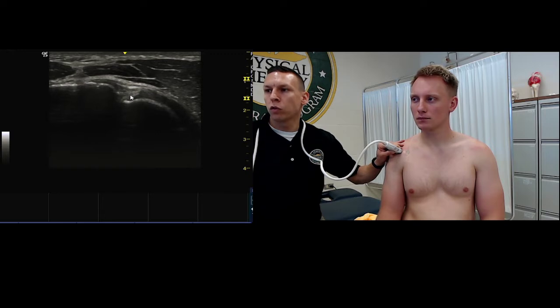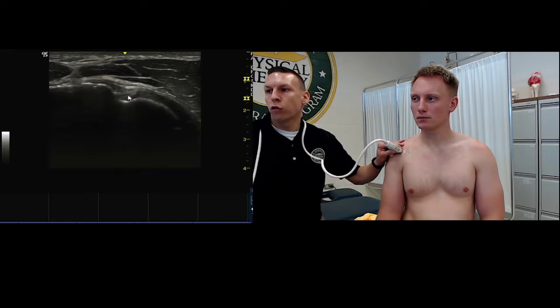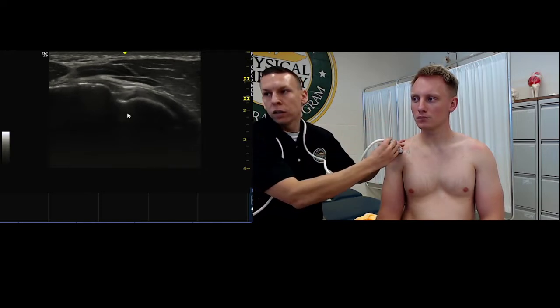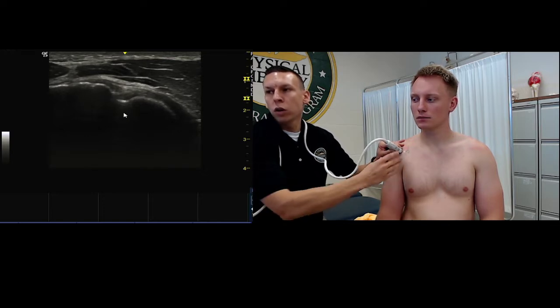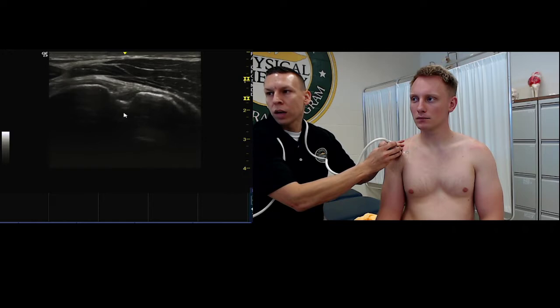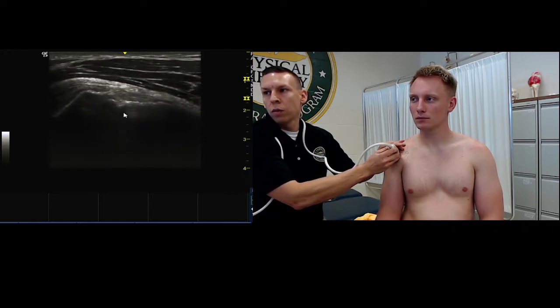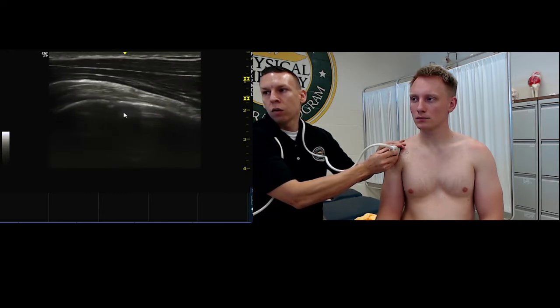But once you've found this tendon, we want to look at it in long axis, and we're going to take our probe after we position it right underneath this indicator, and we're going to turn the probe 90 degrees. And if it's right underneath this little indicator in the middle of the screen, you should be able to keep it right on the screen as you turn it, whether you do this with one hand or two.